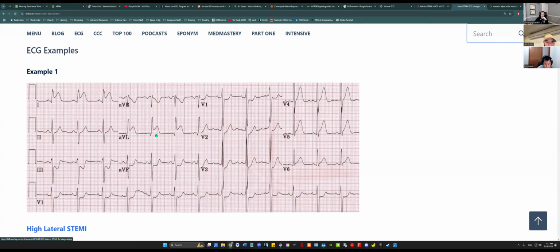Good. And what else is left lateral? V5, V6. Do you see how this T wave is high? And this is about a millimeter up, compared to the QRS. V4 is kind of elevated too, no? Remember, this is all an arc around the patient's left side, right? So it's just that region. No one's hearts are perfectly anatomically aligned.